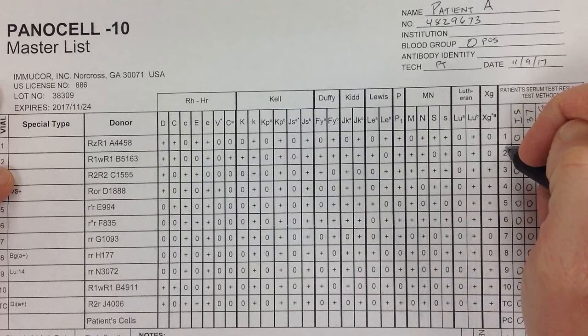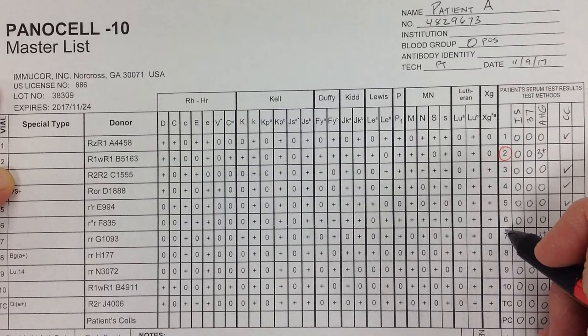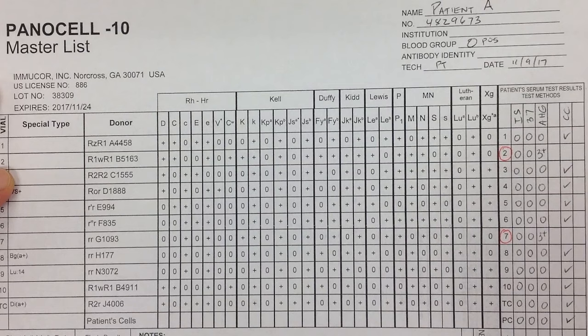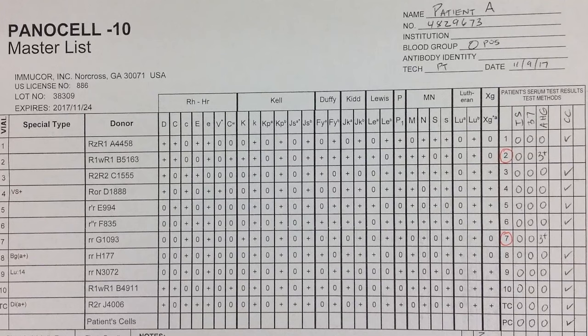So what I'm going to do is circle the positive cells. Vial two had a positive reaction, and vial seven also had a positive reaction — so we just have two of them. Hopefully we're just dealing with a single allo-antibody. If there were more reactions going on it would complicate things, but right now it's looking like it's probably going to be fairly straightforward.